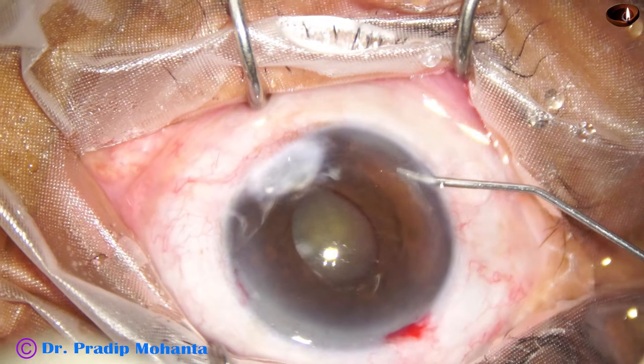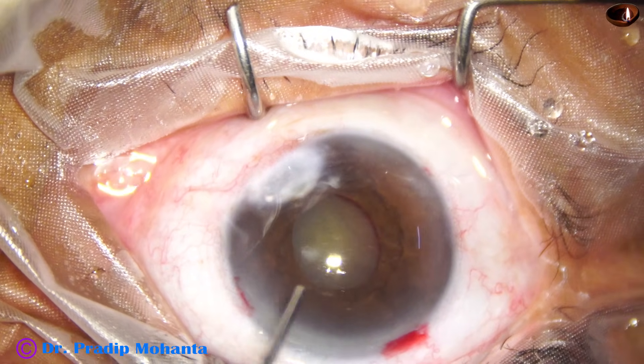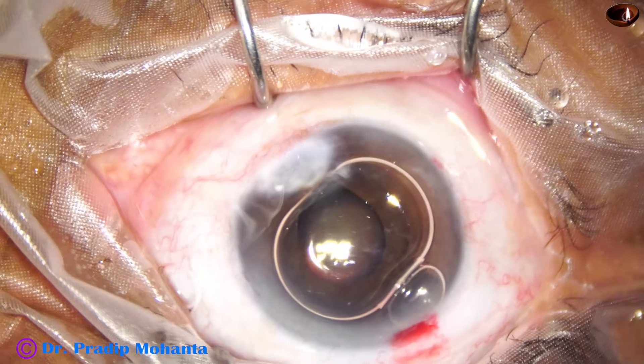By this time the incisions have been made, and now I am going to stain the capsule with trypan blue dye.